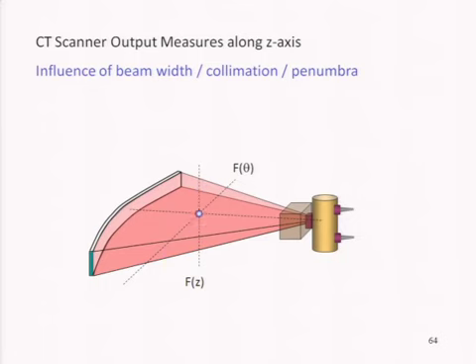And so the idea here is now that the CT beam is so wide, it's almost like a fluoro beam, a high mA fluoro beam that's circulating the patient, why not characterize the beam? When you put a phantom in a CT scanner, the story is a lot more about the phantom than it is about the scanner. I can assure you that, having done many Monte Carlo studies. The measurements that you get out are very much dependent upon the phantom that you put in, not so much, but to some extent related to the scanner itself as well.